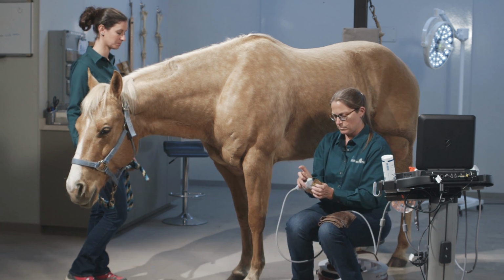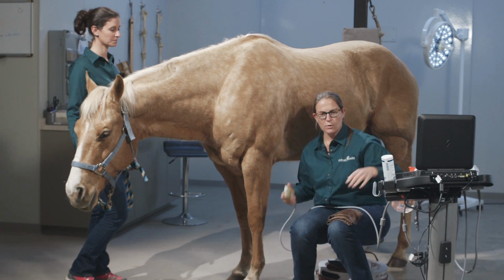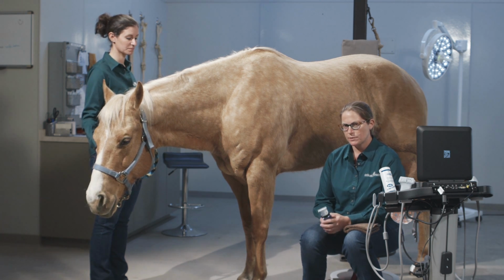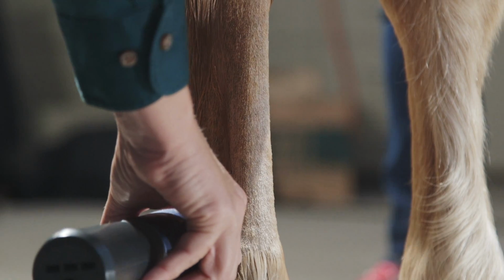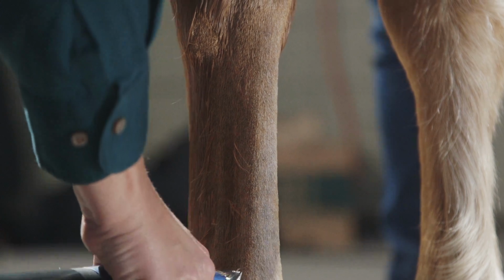He's giving us a very acceptable image, actually. And so even with just a 10 blade, we're getting a very diagnostic image. And then in the next section, we'll talk about how to go about preparing an area for really good image quality using a 40 blade. In the ideal situation, you're going to be able to clip with a 40 blade and take off as much hair as is possible in the area of interest. That's what we're going to go ahead and do next, is take off as much hair as is possible, and then we're going to talk about some tips as to how to get the best image quality in the ideal situation.